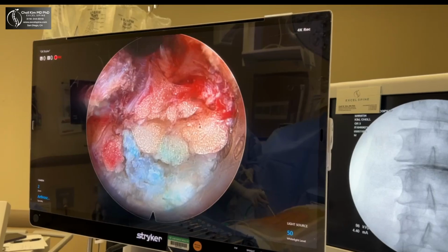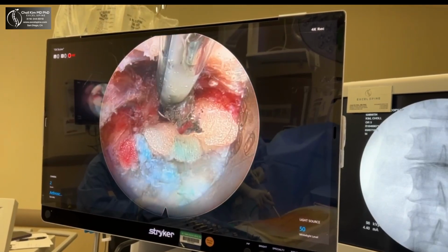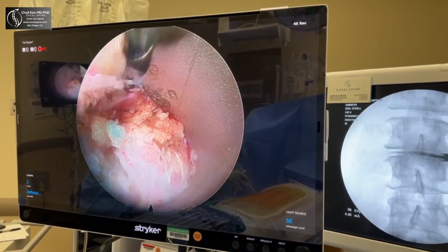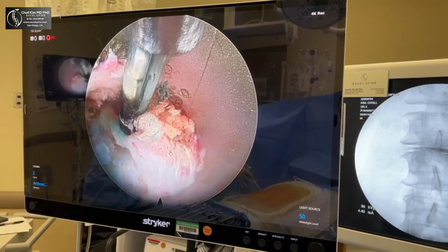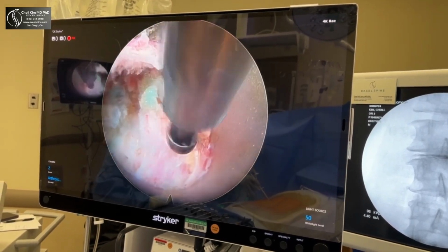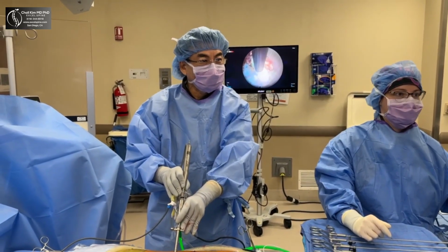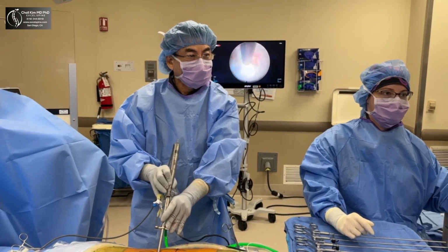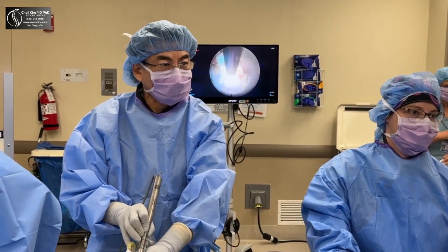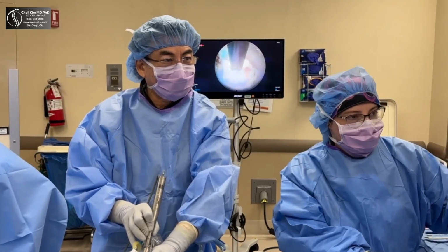Look how red everything is. It looks pissed. That little mound of bone, the exiting nerve is right there. So we're going to flatten that out. You can either use mechanical, and then it stops right there, or the most awesome new instrument called endosonic. That's actually moving, but it's just oscillating back and forth like a cast saw. But it's based on technology called the sonicator. It's just vibrating microscopically back and forth really, really fast.